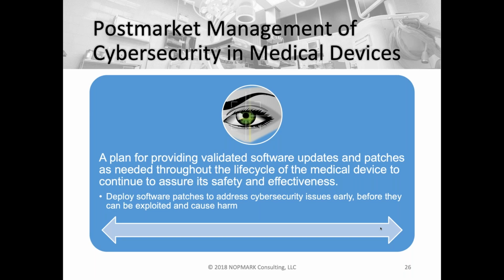Software testers today will start getting occupied most of the time in this aspect of post-market surveillance or post-market management. Because whether you're running a cloud app, or software that's on a device, on a mobile platform, or on a desktop, all of these types of medical device software have vulnerabilities that occur all the time.